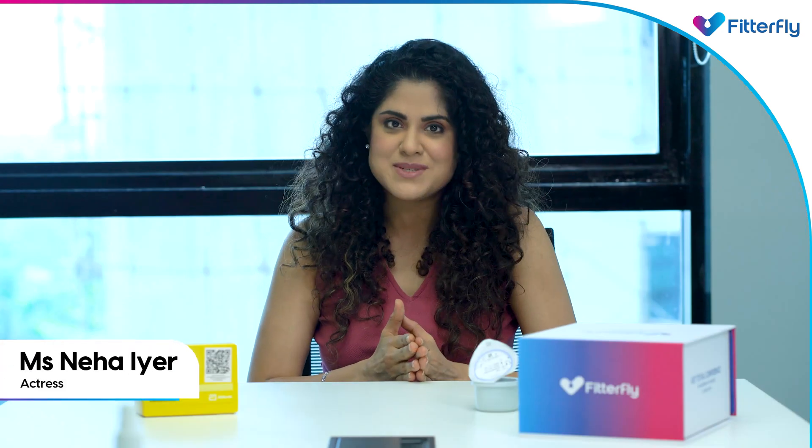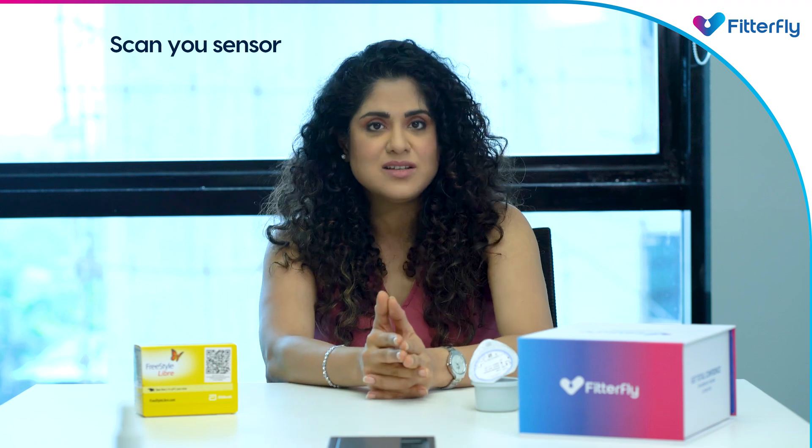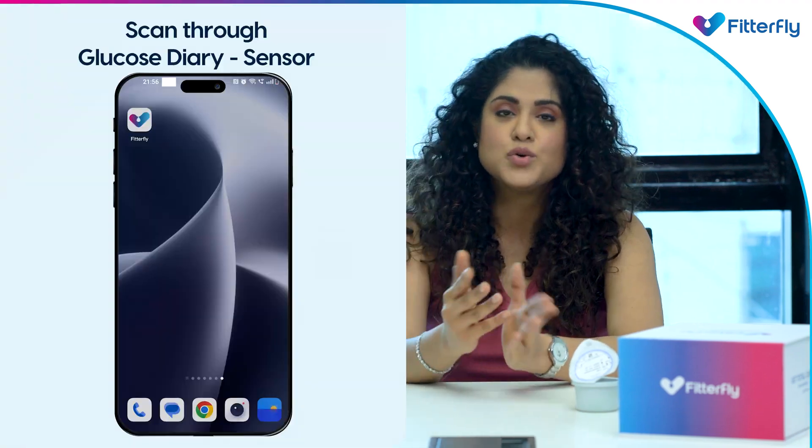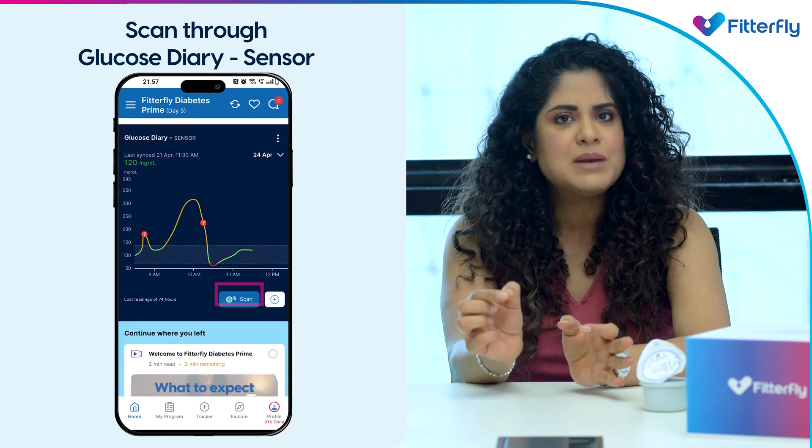It's been an hour since you paired your CGM sensor. Now it's time to scan it. To scan your sensor, open the Fitterfly app, go to your home page, go to Glucose Diary, then Sensor, and click on the Scan button.